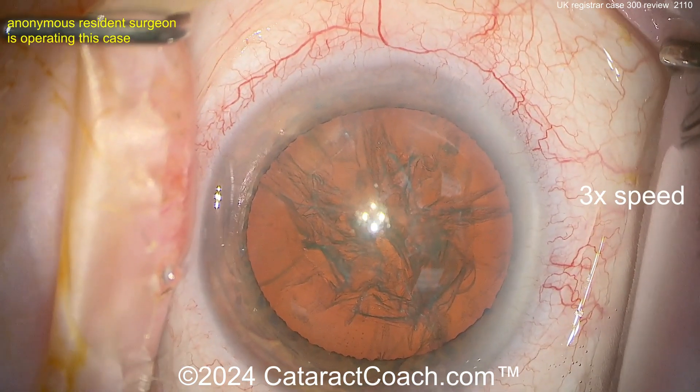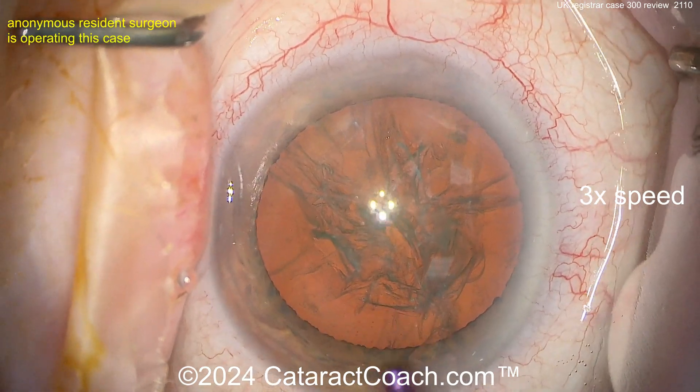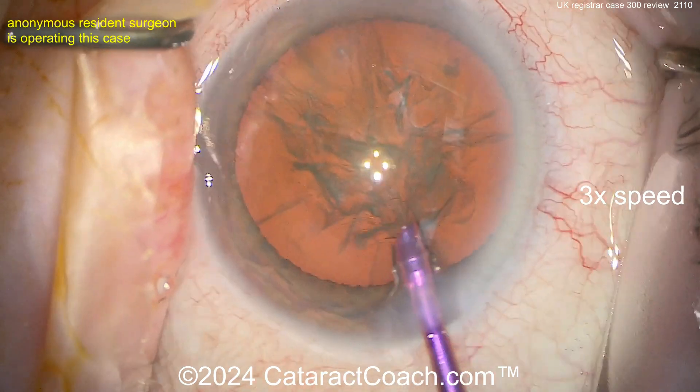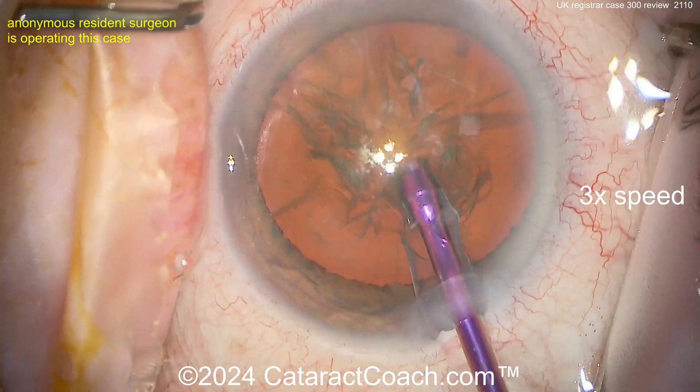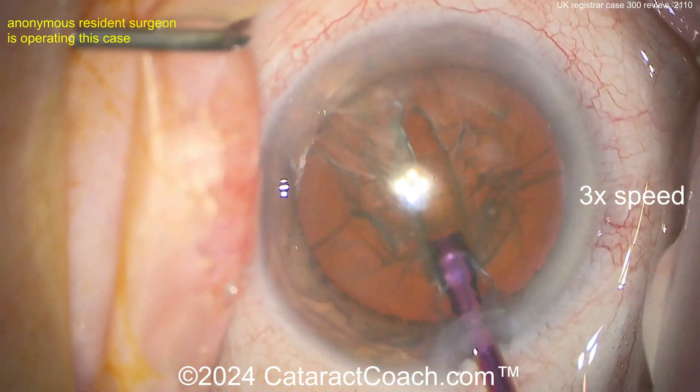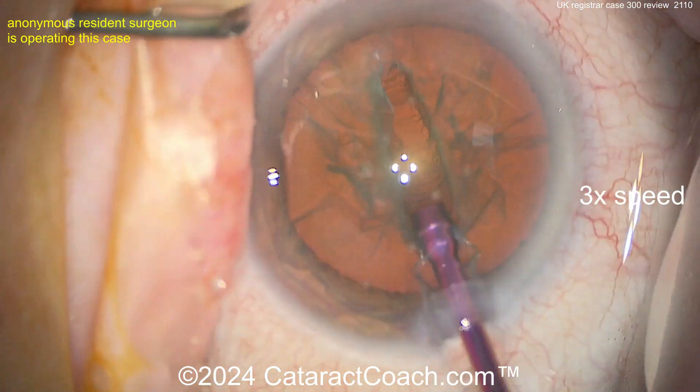Hydrodissection has been done. Here's the phaco tip going inside the eye — bevel up — and a groove down the middle. Look at that groove, nicely done. Look how the Purkinje image stays in the center of the eye as the groove is being made.